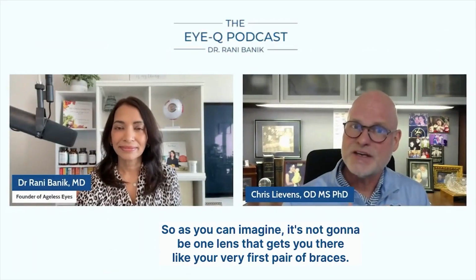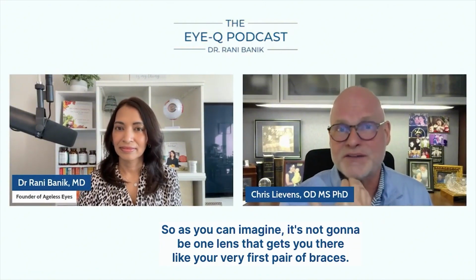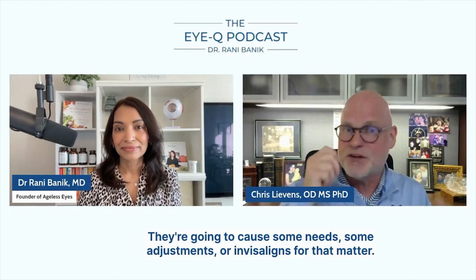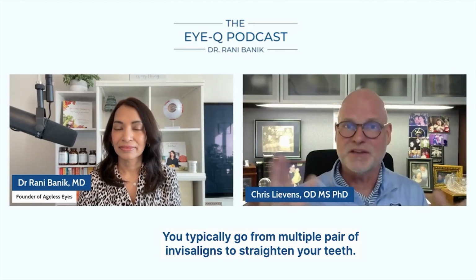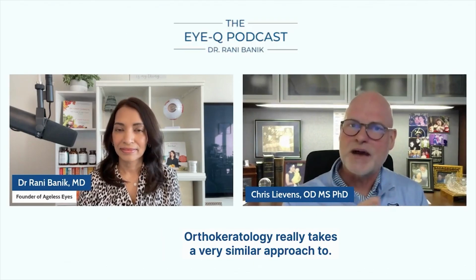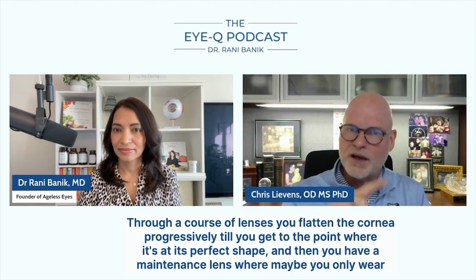As you can imagine, it's not going to be one lens that gets you there, like your very first pair of braces. They're going to need some adjustments, or Invisaligns for that matter. You typically go through multiple pairs of Invisaligns to straighten your teeth. Orthokeratology really takes a very similar approach, with a course of lenses.